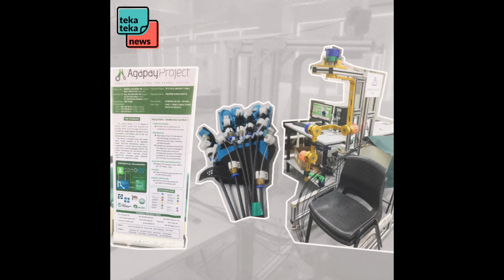Here's how it works. So, meron siyang fingers. Ito yun. This is for the arm. So, yung sa arm, as you can see, it's a bit heavy duty. So separate na talaga. Separate talaga siyang unit. Ito yung original niya na design. So, it's a glove that has a cable attached to each of the individual fingers ng mismong glove natin. And you can basically use the cable to pull or push the fingers into position.